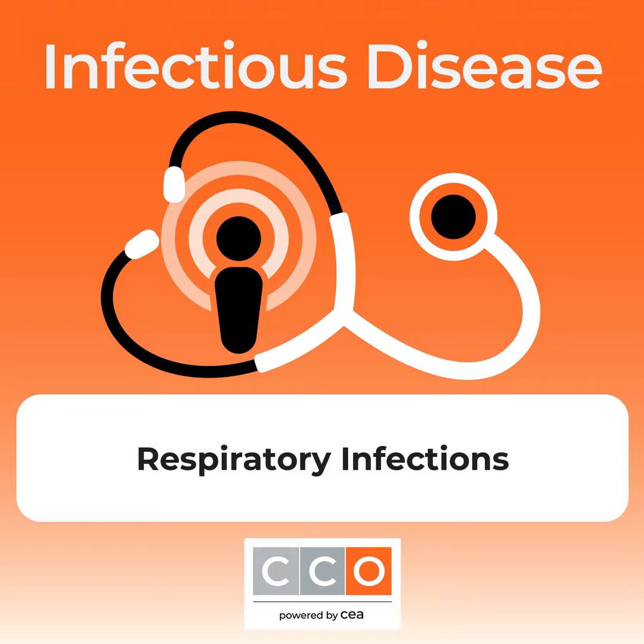Now, there are also lower respiratory tract infection panels, and probably the one that's used most commonly is the BioFire FilmArray Pneumonia panel. This is quite popular because clinical microbiology laboratories often use the same platform for other syndromic panels like bloodstream infection, gastrointestinal infections, etc. And so because the platform already exists, it's sort of much simpler to be able to incorporate this panel. And so this panel can detect many of the bacterial causes of pneumonia. So typically when we're talking about lower respiratory tract infections, we're talking about patients with pneumonia and trying to figure out what the pathogen is.